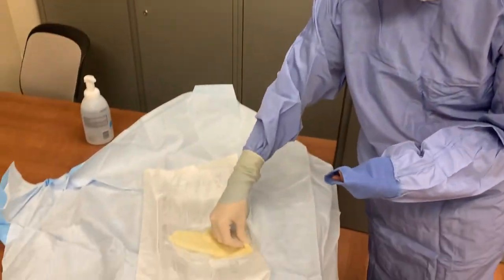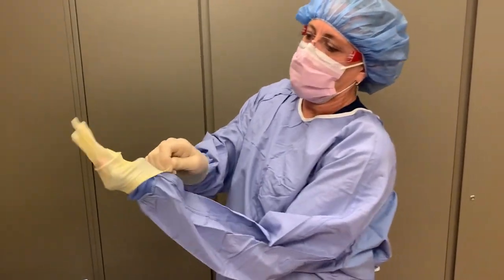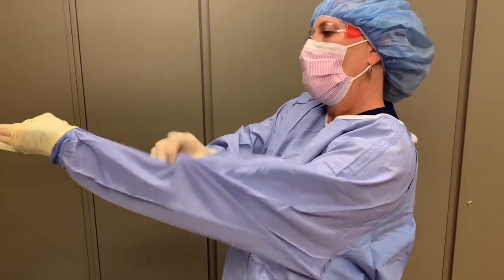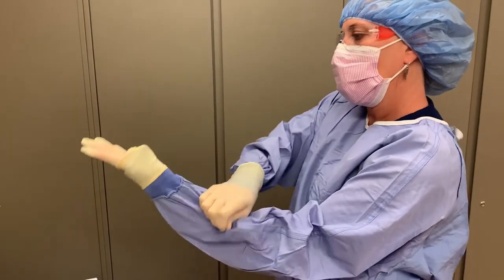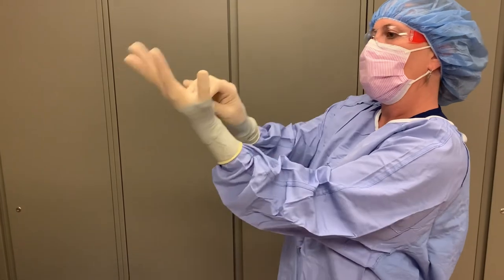With your sterilely gloved hand, you now have more freedom to manipulate the remaining glove, but apply it using the same technique. Keep your hand inside the sleeve's cuff, overlap the gown with the glove, then gently pull the sleeve and glove down to allow your hand to slide into the glove.